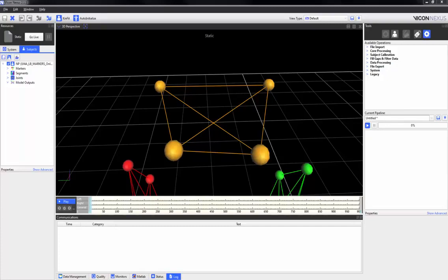Biomechanical modeling can also be done with Python, the free scripting language. Just like the MATLAB interface with Nexus 2, with Python you can edit the C3D file directly — for example, you can set gait cycle events, edit the trajectory and analog data, and create model outputs. The advantage of Python is that it is free to use. In this segment, I'm going to show you how to execute a simple Python script from the data processing pipeline, where a model marker will be placed between the ASIS markers and another between the PSIS markers.